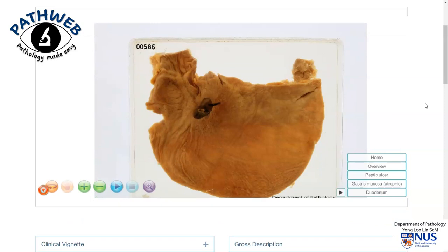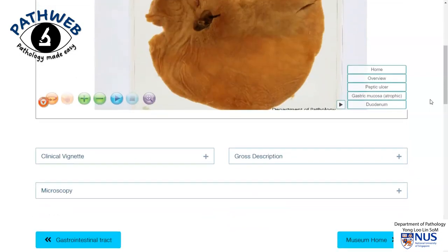And this is the classical appearance of a peptic ulcer. This is in contrast to a cancer which has ulcerated, where usually we would see very thick, heaped up edges.